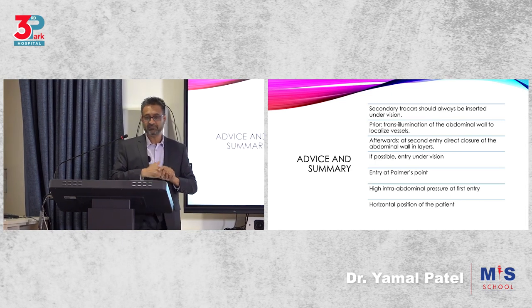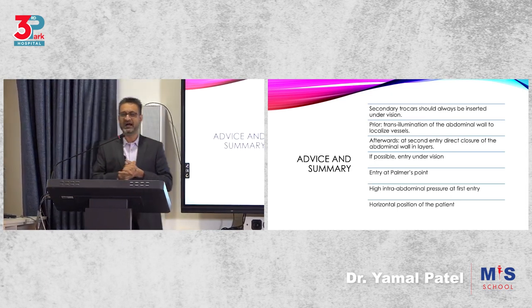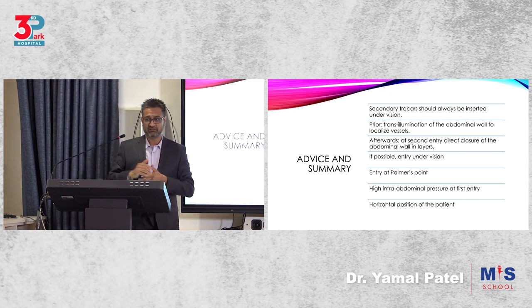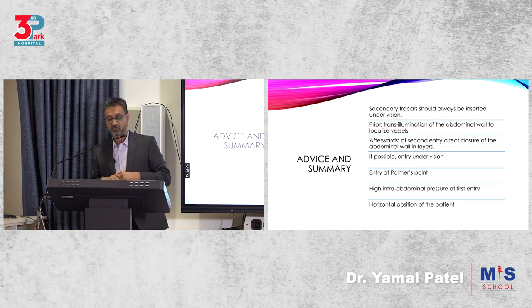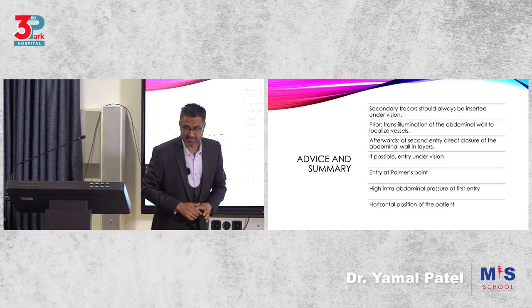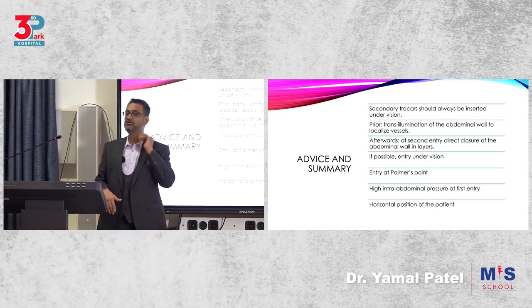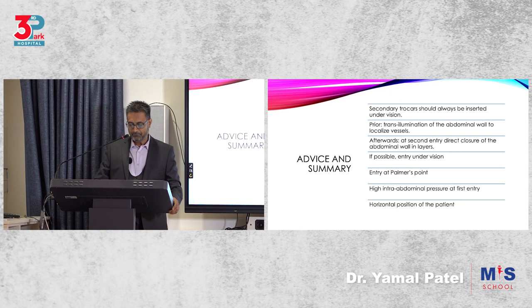If you hit that by mistake, it has caused mortalities, because it's a very high pressure vessel arising from the external iliac artery. You could try to transilluminate to see the small superficial vessels. You can't transilluminate the inferior epigastric, it's under the muscle. But you can transilluminate those superficial vessels just to avoid them if you can.